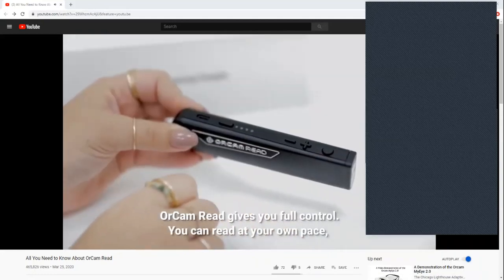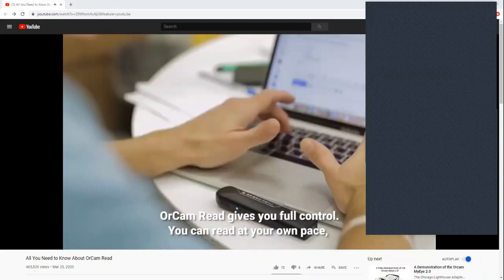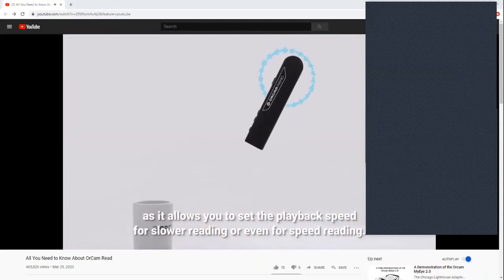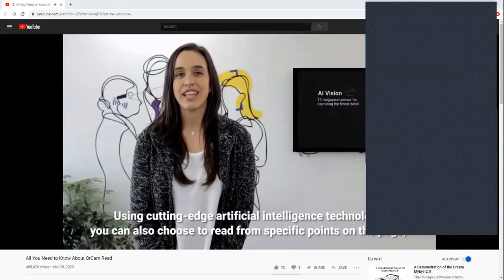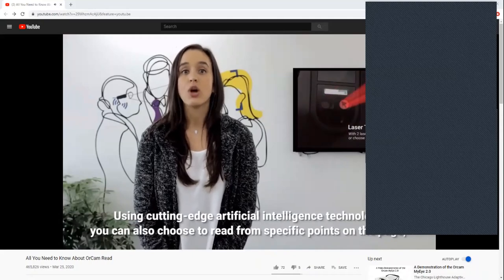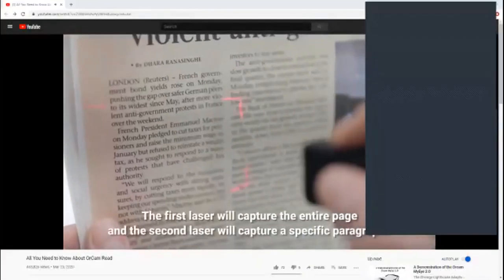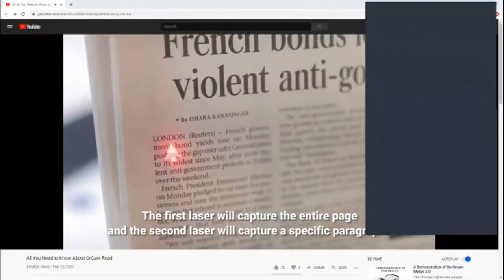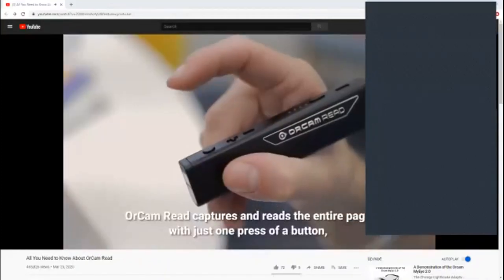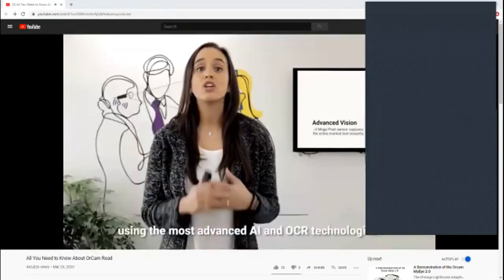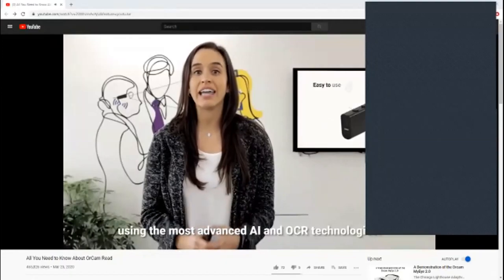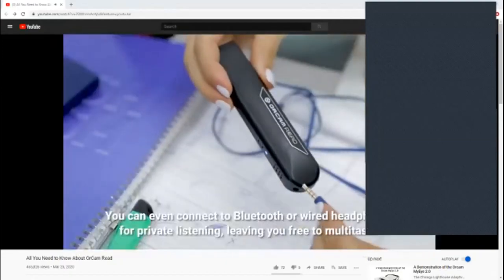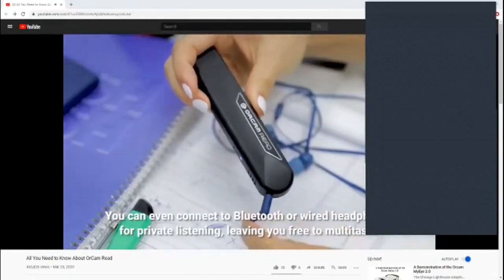OrCam Read gives you full control. You can read at your own pace as it allows you to set the playback speed for slower reading or even speed reading. Using cutting-edge artificial intelligence technology, you can choose to read from specific points on the page with two different laser capture settings. The first laser will capture the entire page, and the second laser will capture a specific paragraph. OrCam Read captures and reads the entire page with just one press of a button, using the most advanced AI and OCR technologies.